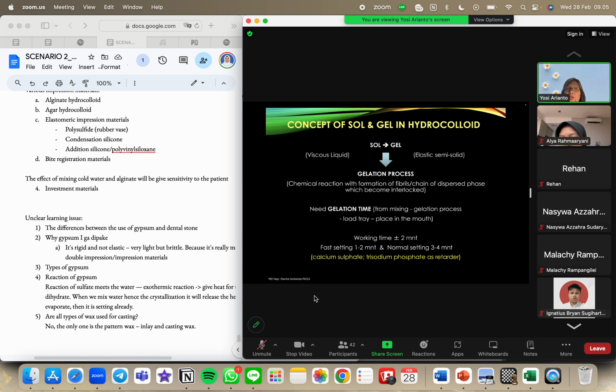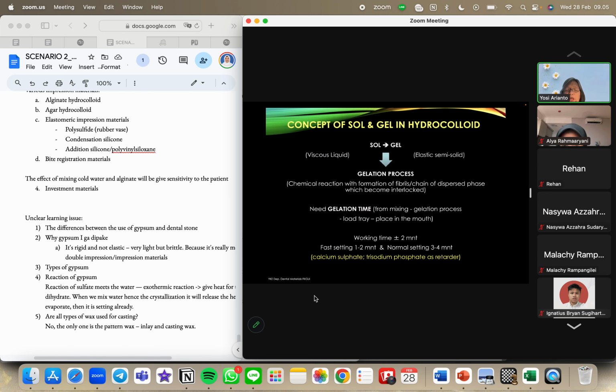It is also called the working time until the setting time of the alginate. The working time is usually 2 minutes, and if it is a fast setting alginate, we need 1 to 2 more minutes for the setting time, and for normal setting time it needs 3 to 4 minutes to set.